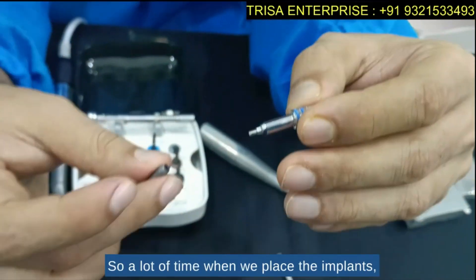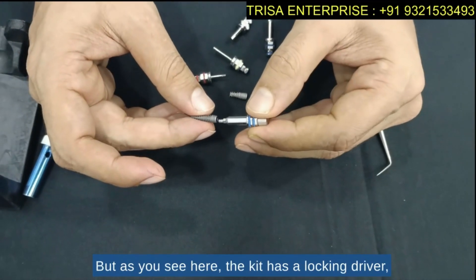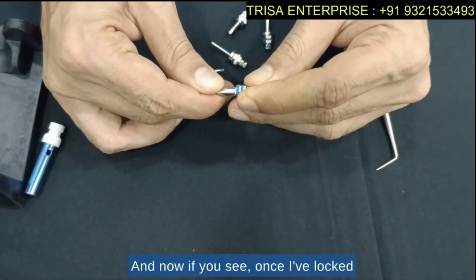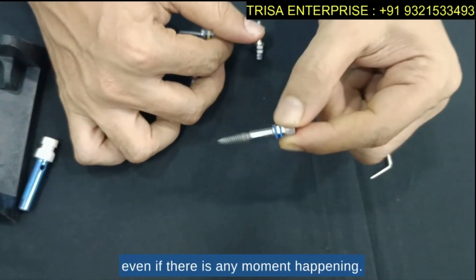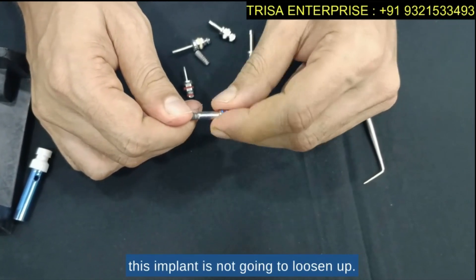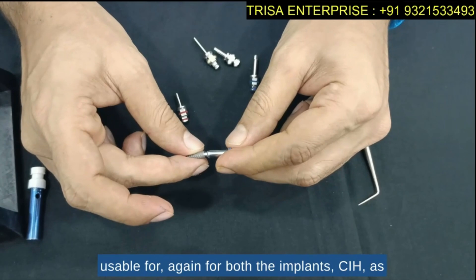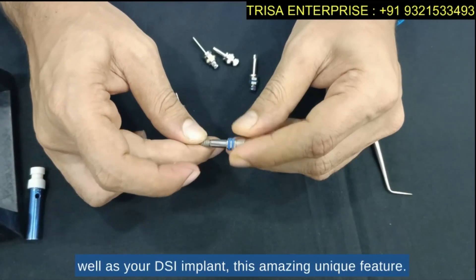A lot of the time when we place implants, they tend to fall off the driver. But as you can see here, this kit has a locking driver — I can place this driver and lock it. Once locked, this implant is never going to fall, regardless of any movement. Unless you open the lock, the implant will not loosen. This amazing lock works for both the CIH and the DSI implant.